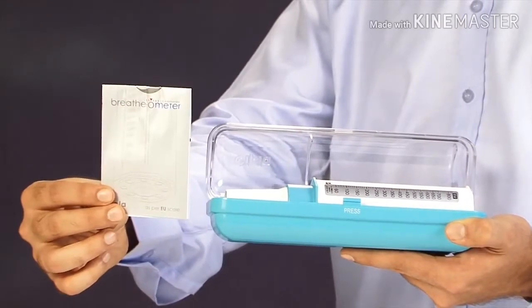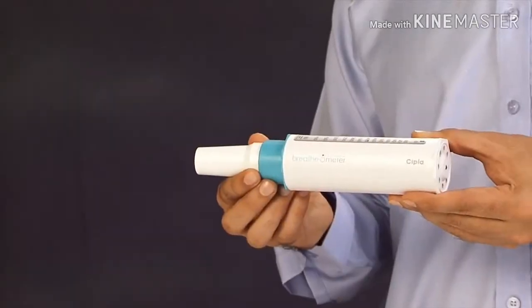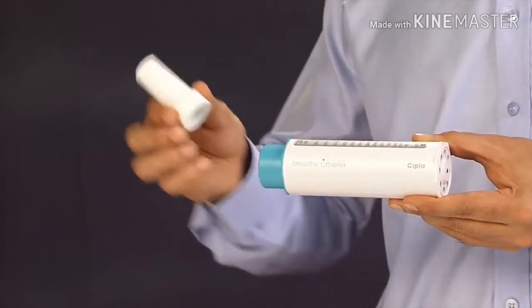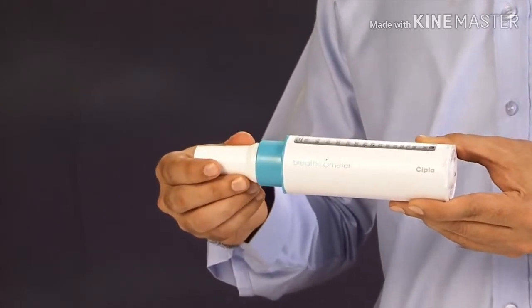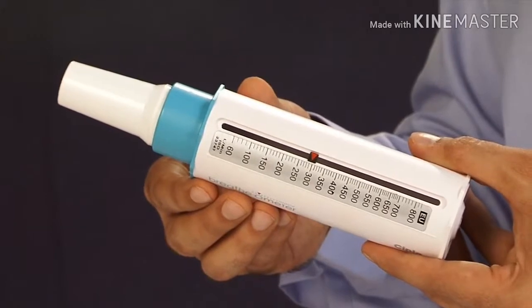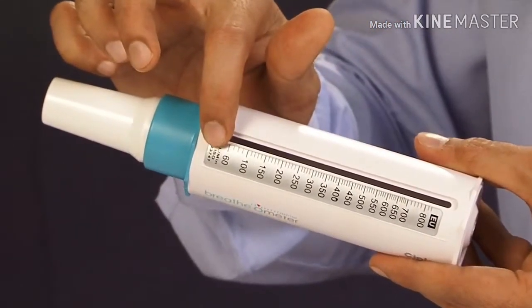This is the breathometer and this is the mouthpiece. Please attach the mouthpiece to your breathometer in this manner. First of all, move the pointer along the slot towards the mouthpiece until it does not move any further.